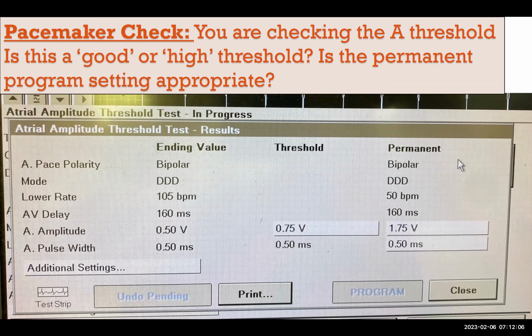In a permanent pacemaker, we program the volts and the pulse width, and just get a current that is dependent on those two features. So what do we normally say? If you're at the bedside and the threshold was 5 milliamps, what would you set the pacemaker at? You would want to set it to twice that much. Right, so you'd set it at 10. The same thing goes for permanent pacemakers.